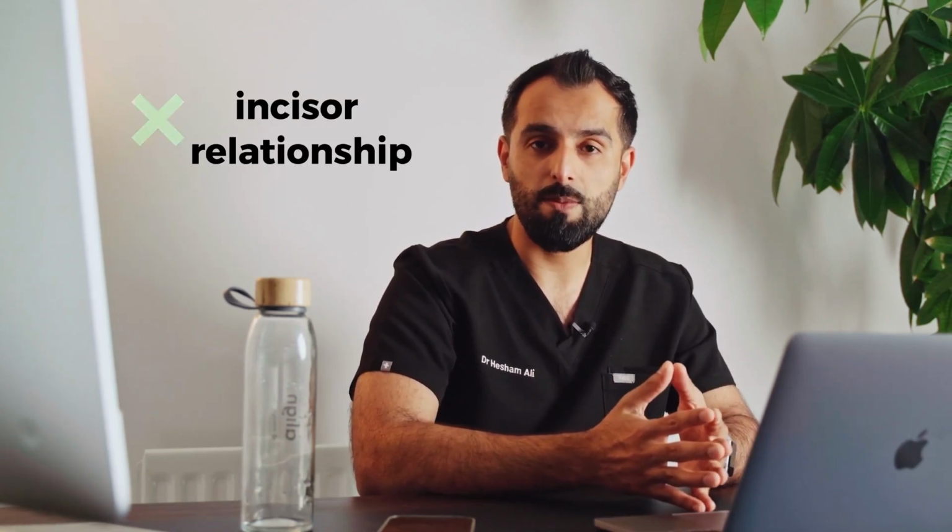Once you've done that, we start looking at the different relationships that we are trying to correct or not correct. What I mean by that is, are we going to accept the incisor relationship at the end of treatment or not?